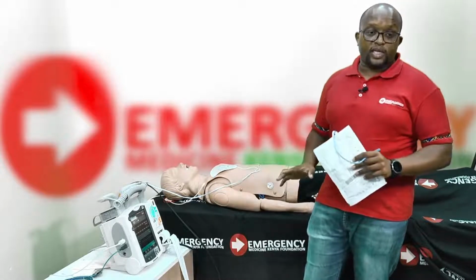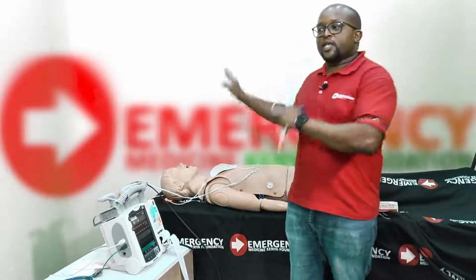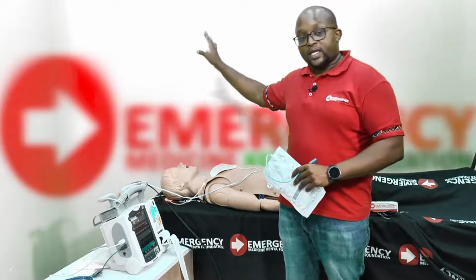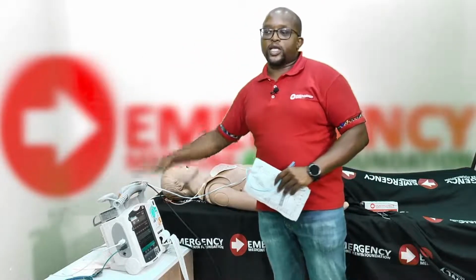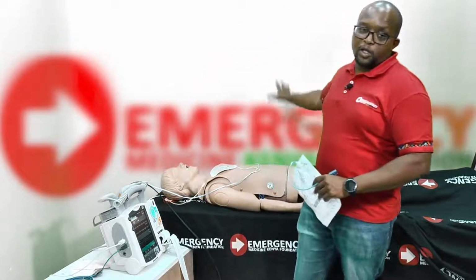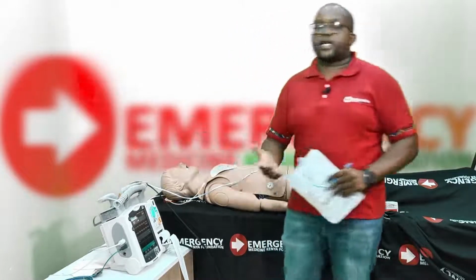Many people don't know how to do this, but do not stop pacing. You can easily transfer the patient to another machine by setting another machine on a higher heart rate and setting the primary machine on demand mode, so that when the new machine takes over and you've confirmed electrical, mechanical, and physiological capture, then this machine goes into a standby mode and you can disconnect the patient safely.